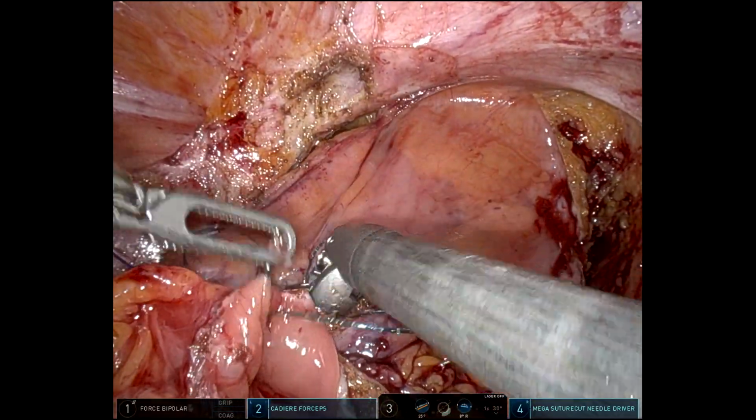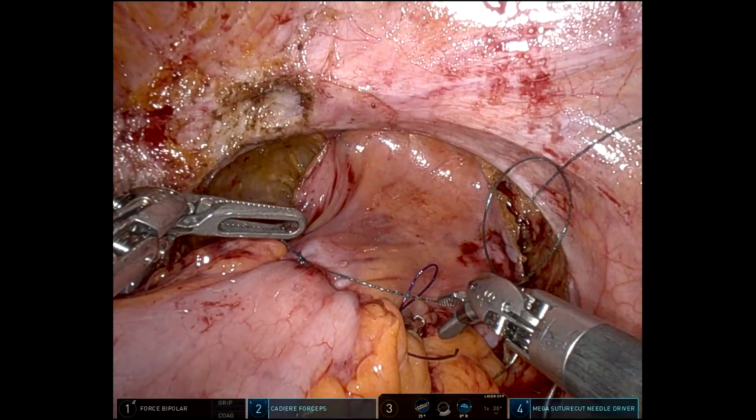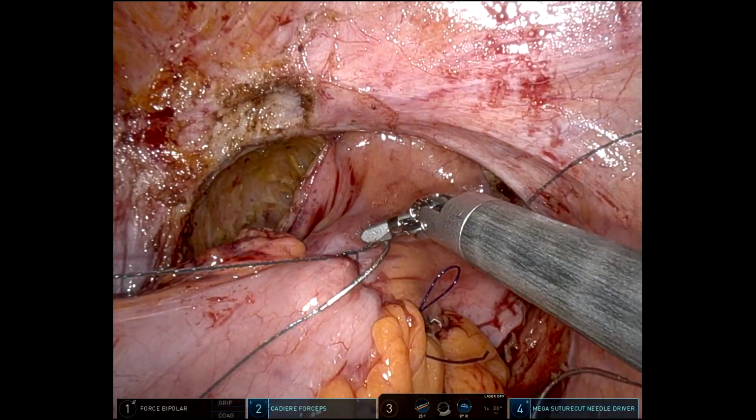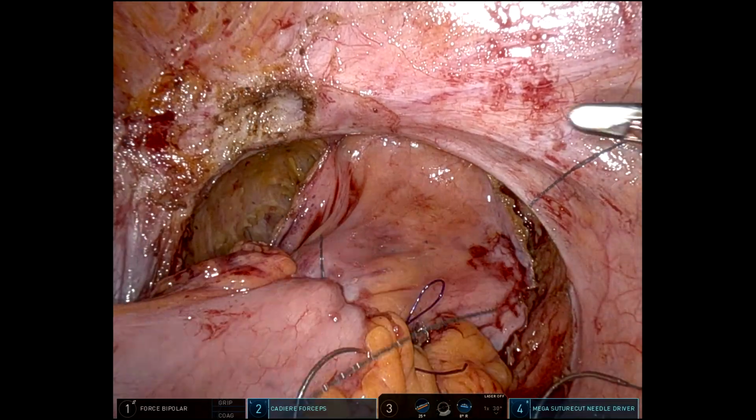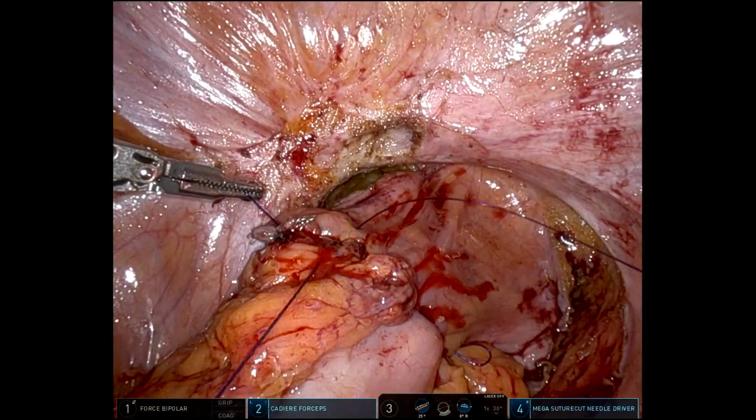This is just showing how I like to sew out to the left when we get started, and then I sew another one out and around the right. I tie those two to the center together up over the top, and then we do another layer of 2-0 PDS.